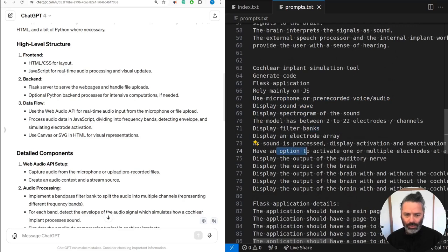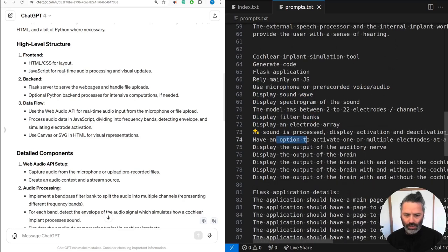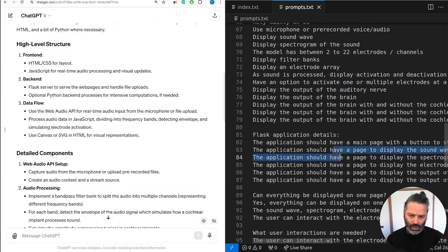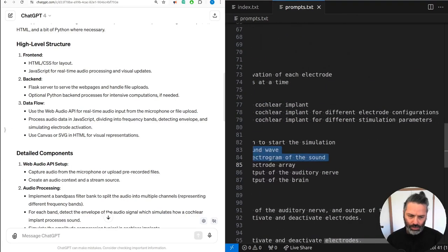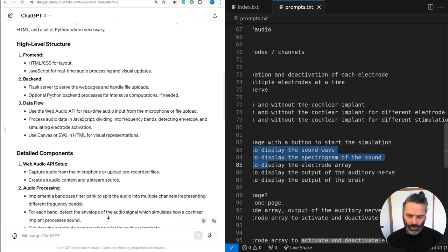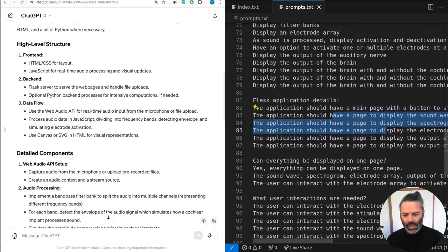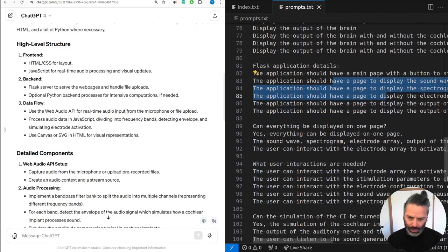Have an option to activate multiple electrodes. Yes, it added a bunch. When it's adding stuff, it's just repeating itself over and over again. Flask application details, that's what it's all about. Electrode array, output auditory nerve, can display on the same page. I want to display everything on the same page. Sometimes it defaults to having separate HTML pages.